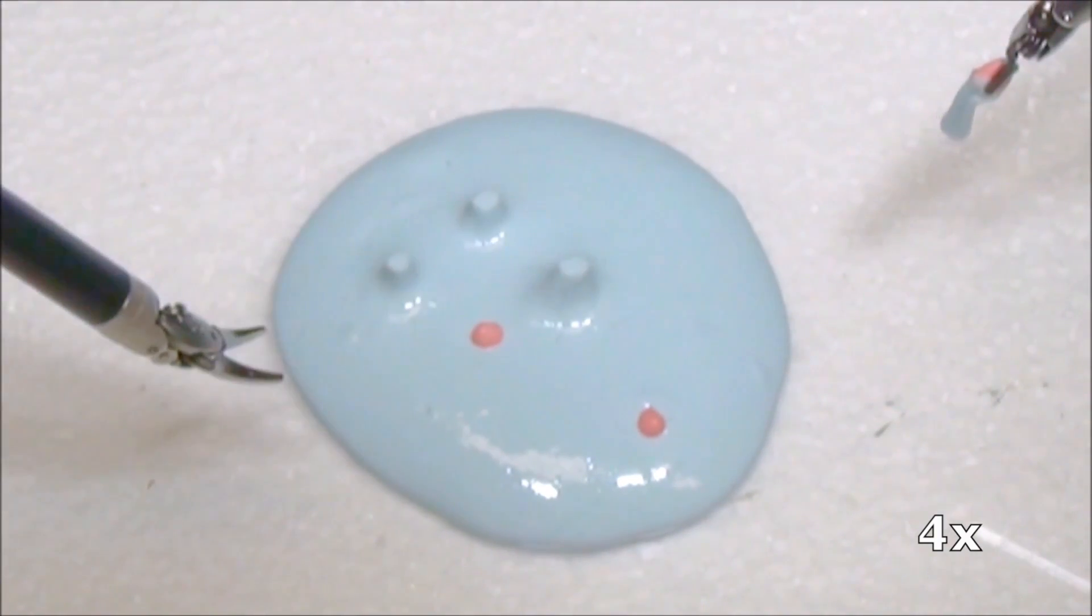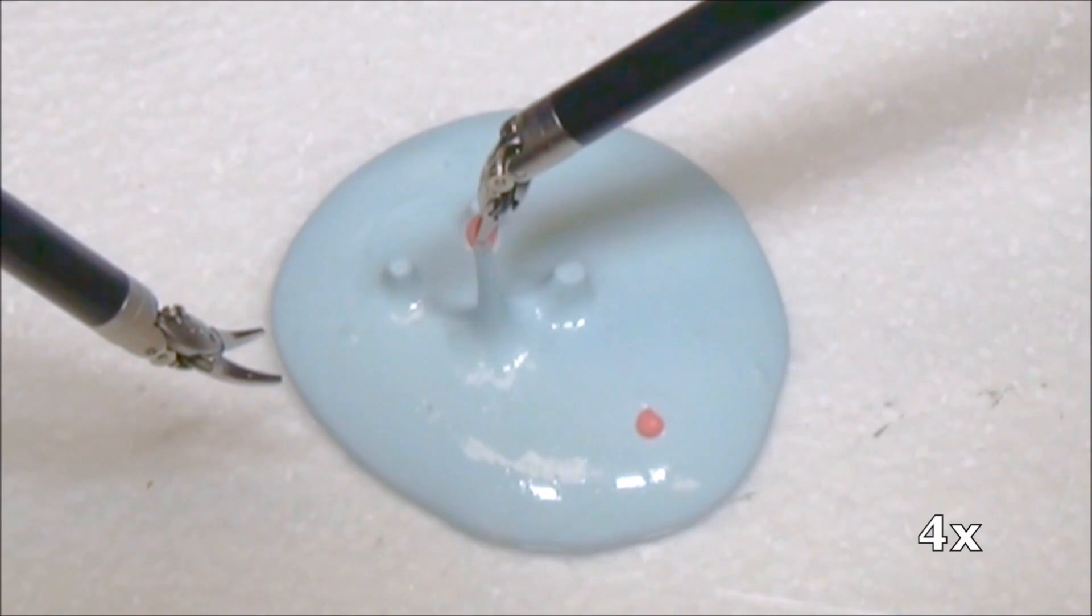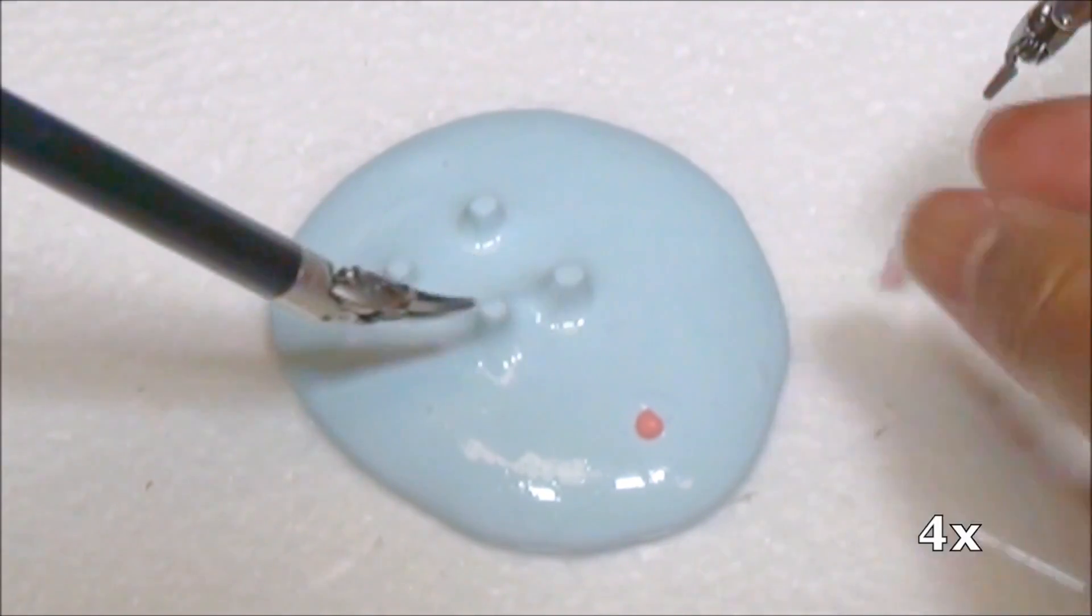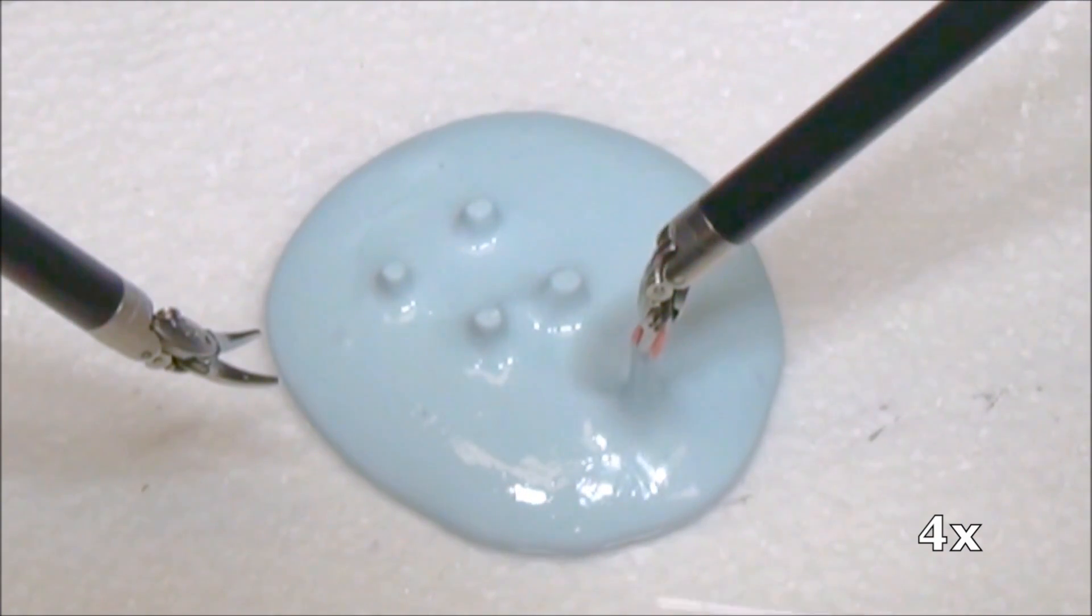These targets represent damaged or tumorous tissue. A computer vision system identifies the target spheres and guides the robot to extract them. In 50 trials, the robot achieved a 96% success rate.